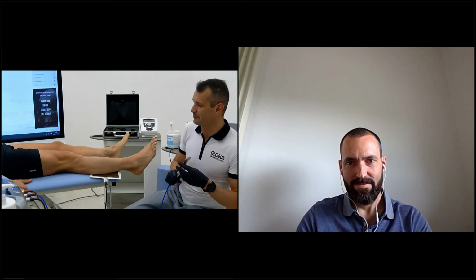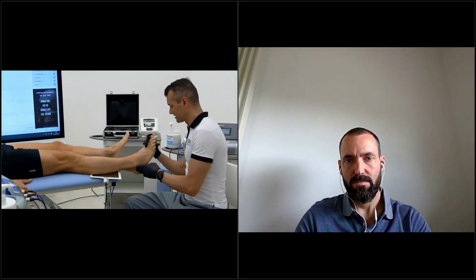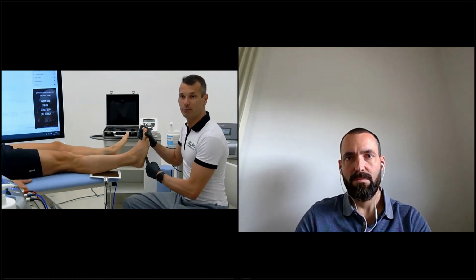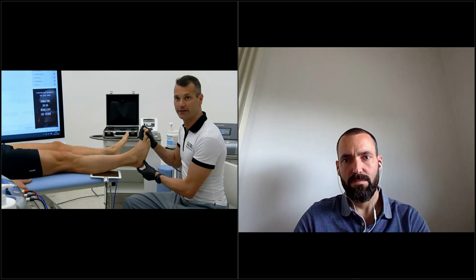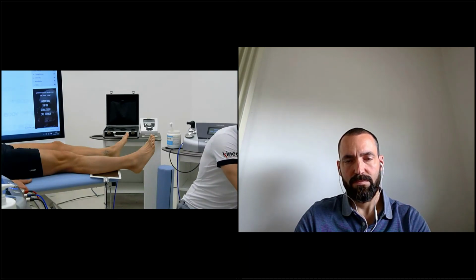I had some patients with heel spur. That is a different kind of pathology, as you know. It is not plantar fasciitis, but more proximal, in the calcaneus area. For reaching those deep tendons, I want to show you here because it's very interesting to understand what I'm talking about.